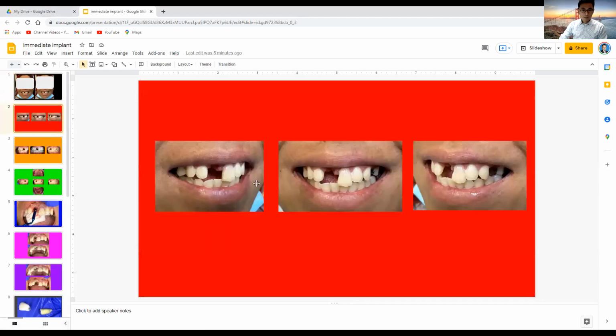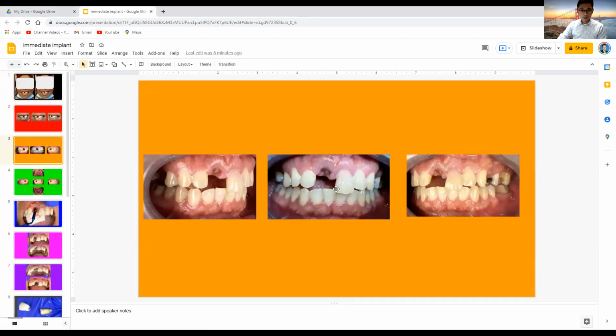In another picture, zoomed in, you can see the patient has pretty much really tissue damage there. The tooth here, number 9, is a lot longer than the other tooth, so it's extruded. So what's the plan? What are you going to do? Here's another picture of the inside of the mouth. She came in about 10 days after the tooth avulsion. She couldn't find a dentist that could take care of this case. Those pictures say a thousand words. The tip is missing here. What is your approach for this case?